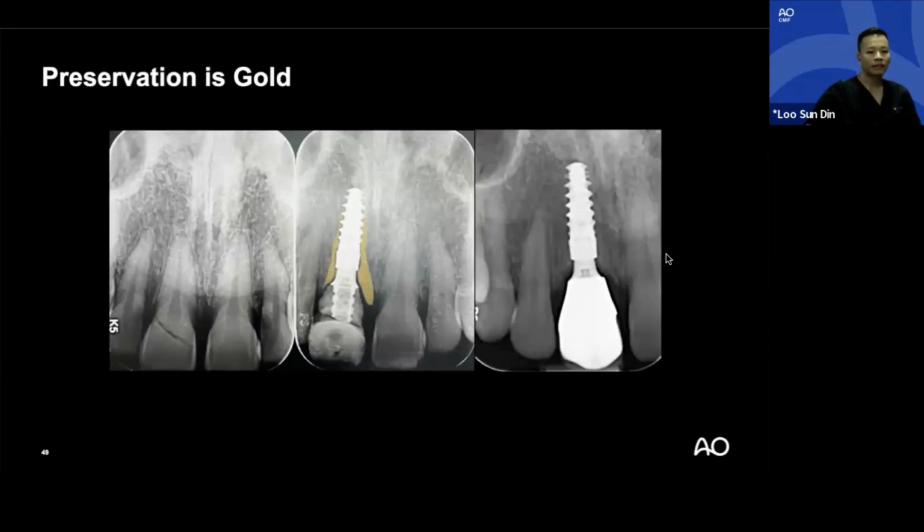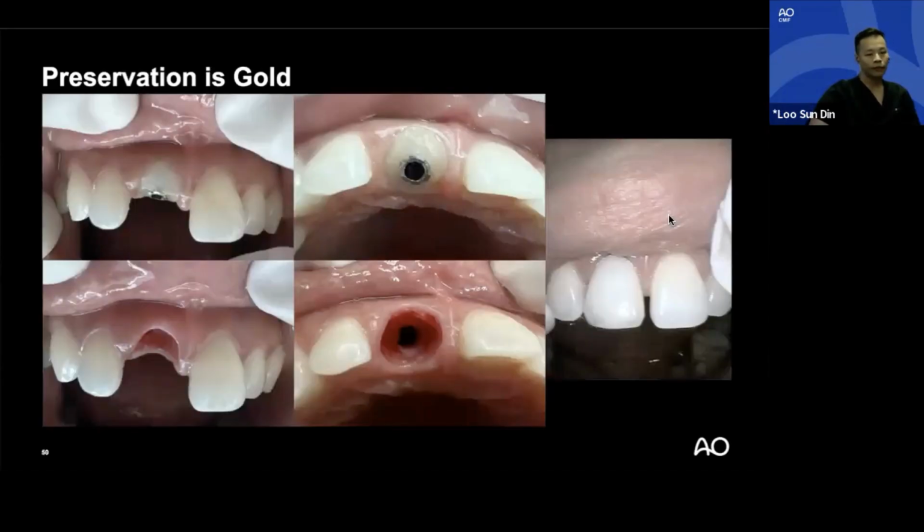And do remember Dr. Bruce's research, and don't forget the bundle bone resorption. That's going to happen no matter what. And place an incision at the labial frenum, tunnel graft it to the buccal, and then basically graft the buccal on the same day of implant placement, immediate implant placement. If you do it well, and if you're lucky, and if I'm lucky this time around, I end up with a pretty good result and the patient's happy. We managed to preserve all the architecture and we achieve what we want.